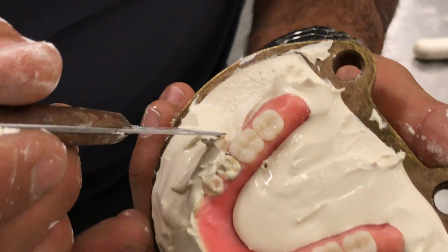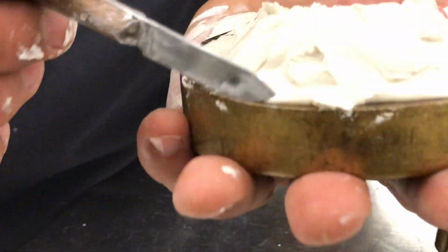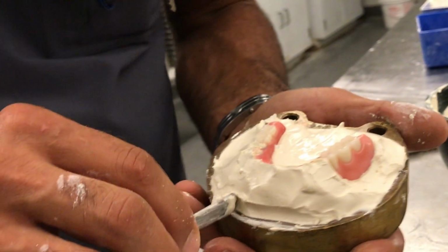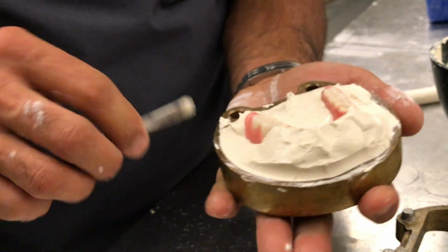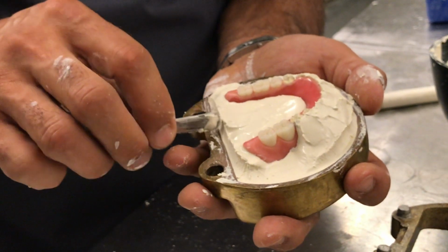So now the stone is starting to set. It's been about 5-6 minutes now that I can actually start carving the stone instead of displacing it around. So now I can wipe off a little bit of my instrument, carve the outside first to expose the ledge of the flask, wipe off the excess against the bench or the back of your hand. I'm going to expose the ledge of the flask all the way around.